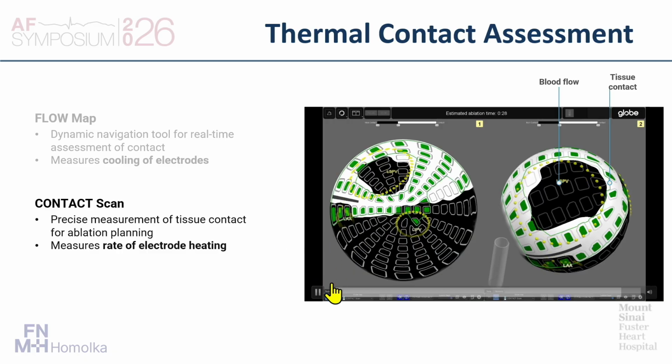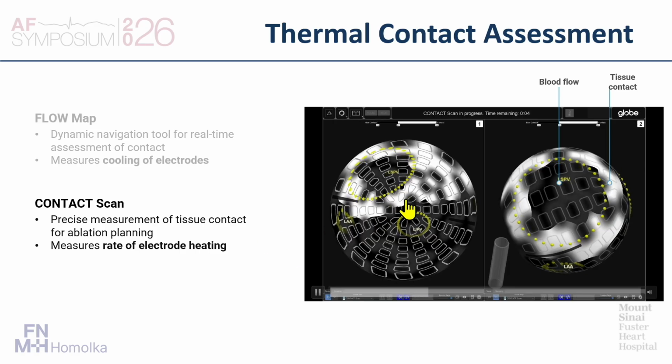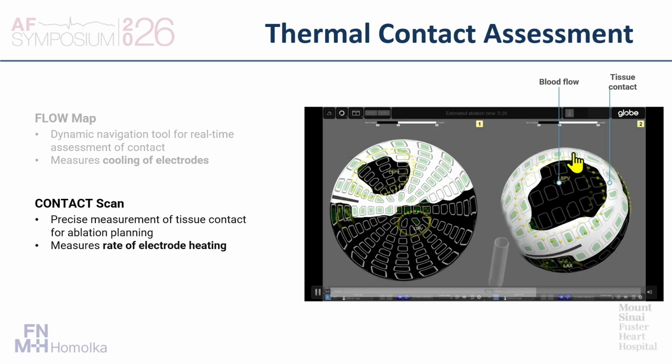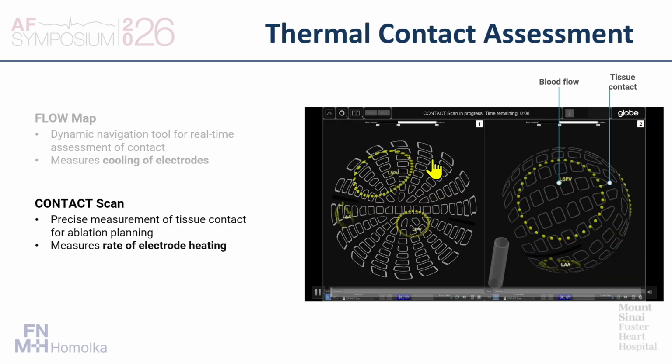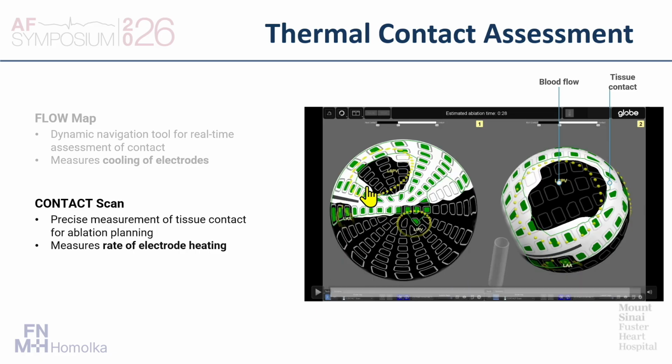So let's just run that one more time. So you start the contact scan. It's running the scan right now. It's thinking I have contact here. And over the course of about 8 to 10 seconds, it says, okay, this is the area. And then it gives you some options in terms of electrodes. And let's just pause it there. These green represent electrodes that you're delivering energy into.